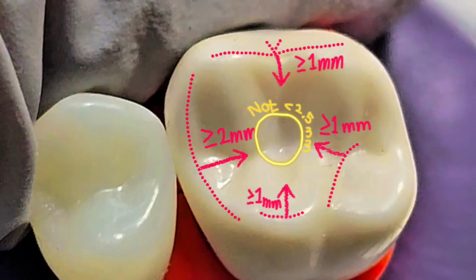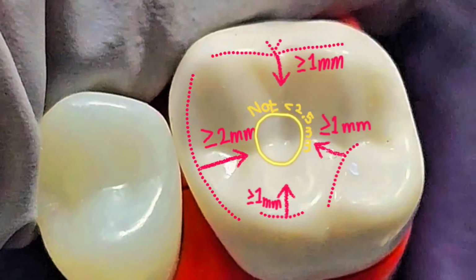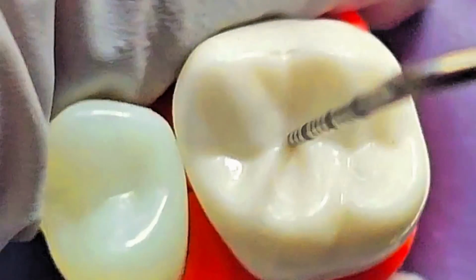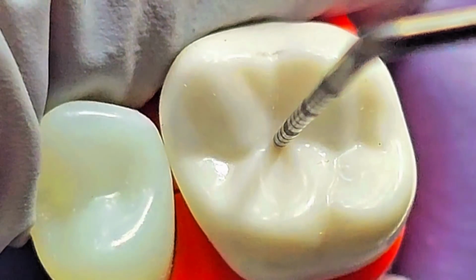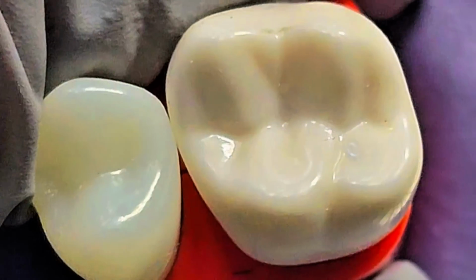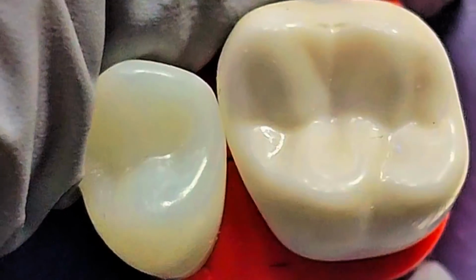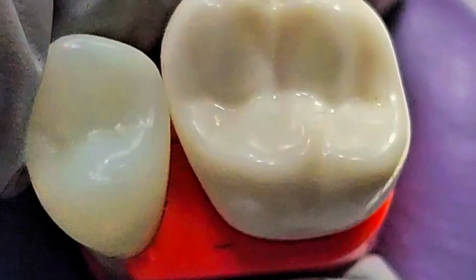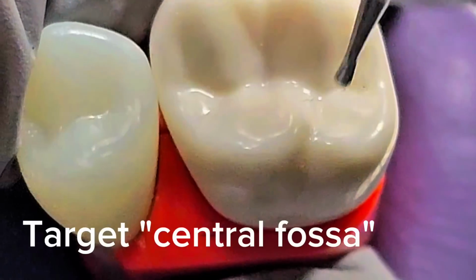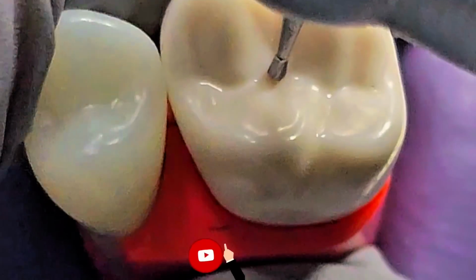So where is the safest area to start? We are going to start right in the center, because this is the safest, since it is surrounded by the area that we can open up. So don't start from this mesial pit, but the central pit, not here but here.